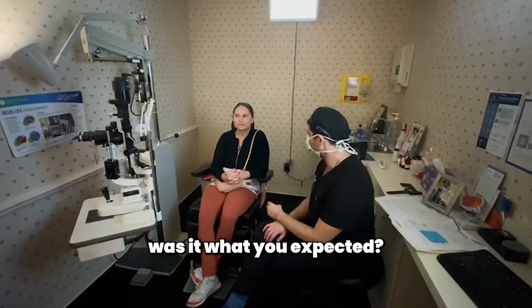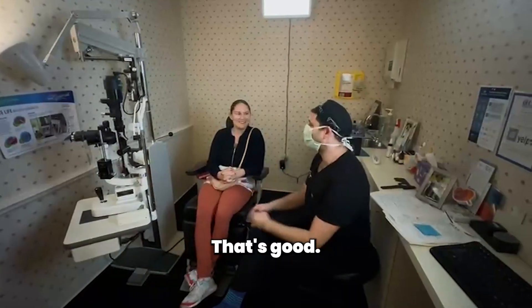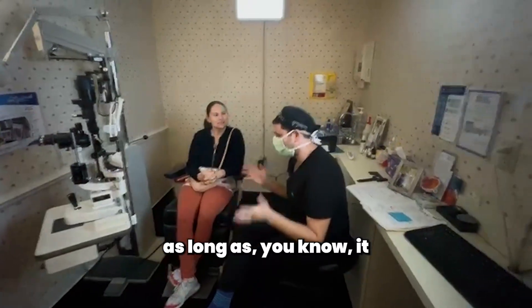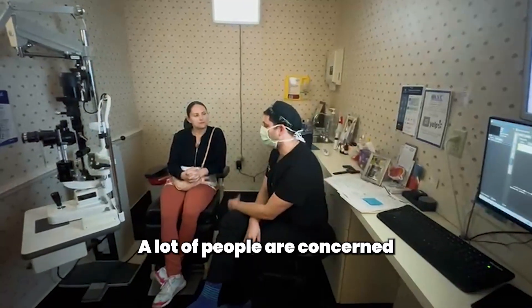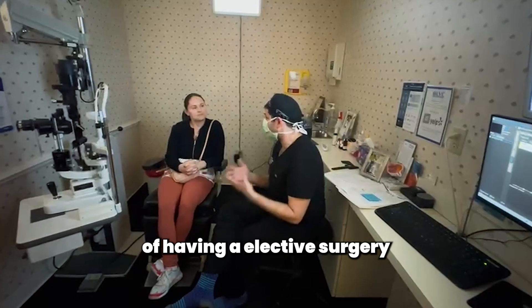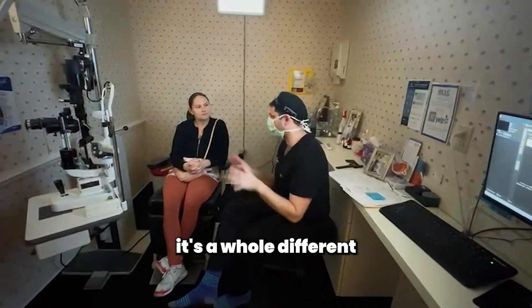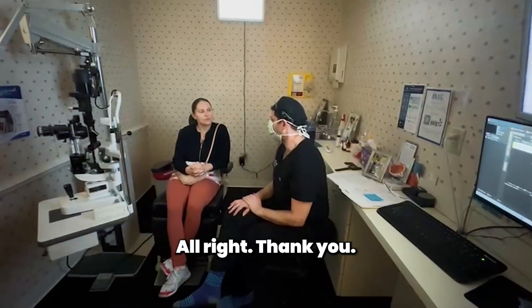Was it what you expected? Yeah, I guess. As long as it was a painless experience — that's the main goal. A lot of people are concerned and afraid of having lens surgery, especially when you're used to LASIK — it's a whole different kind of experience. But you did great. I appreciate it. Thank you.